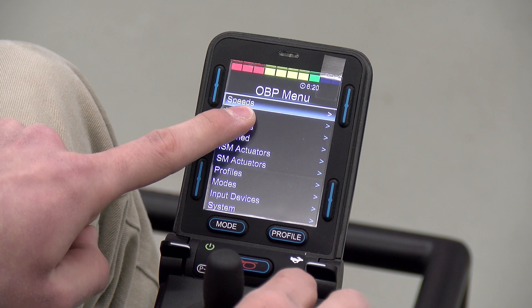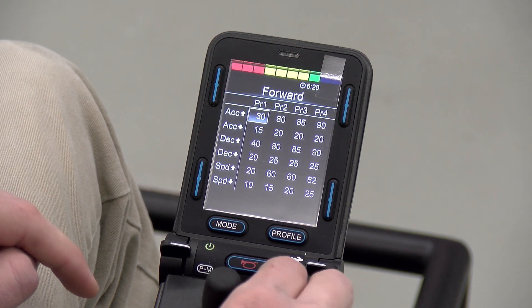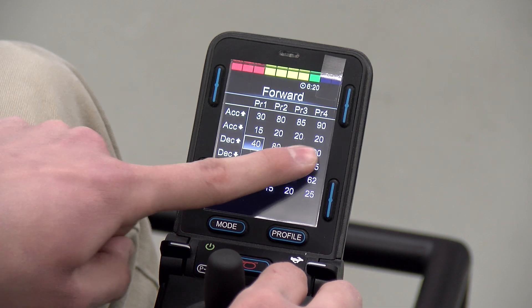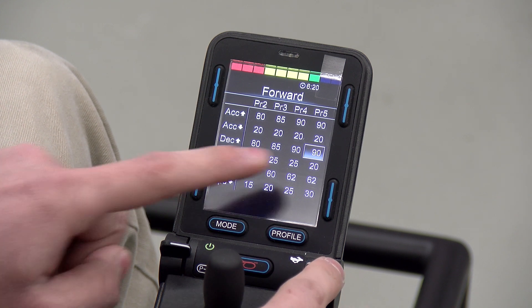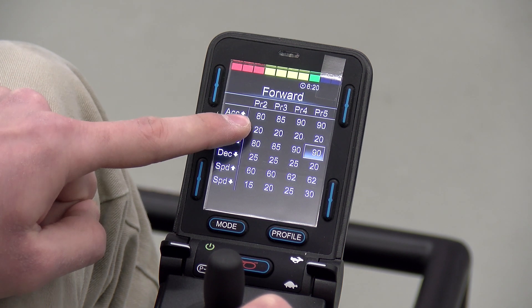Another common question is: how do I stop my chair from being so jumpy and jerky? Two settings you can adjust to combat this are acceleration and deceleration. Acceleration will be how quickly your chair takes off and deceleration will be how quickly your chair comes to a stop. If you're having issues with your chair jumping around, you can play with both of these settings and try to find a combination that works for you.